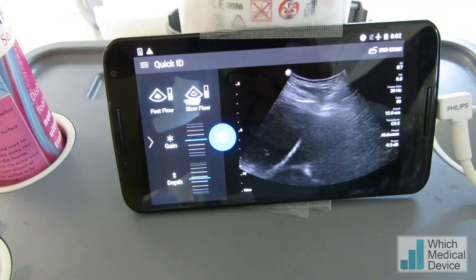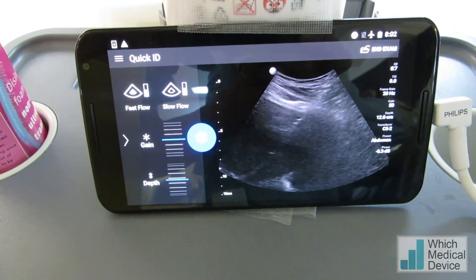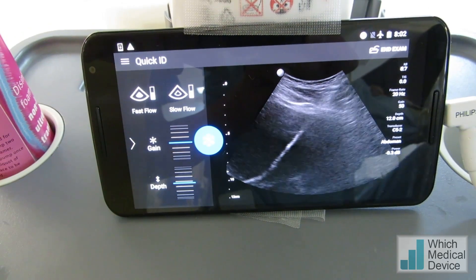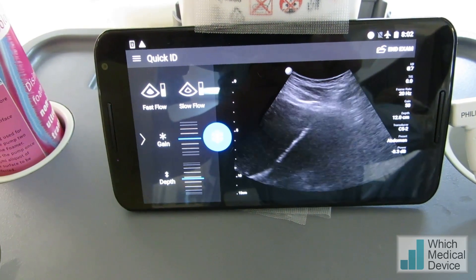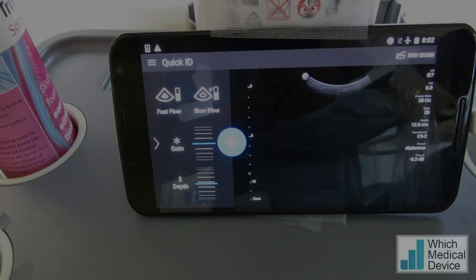We're now inserting the nephrostomy in, a bit of pushing. That's it gone in over the guide wire. Then we can take the guide wire and central trocar out, and that's the nephrostomy in situ. That's the shape. Let's pull it.